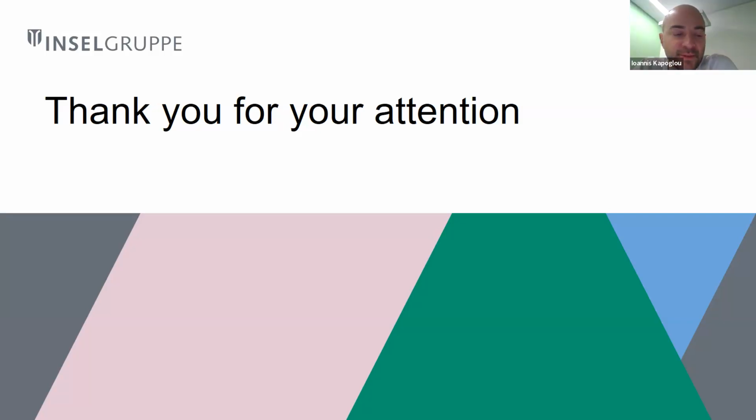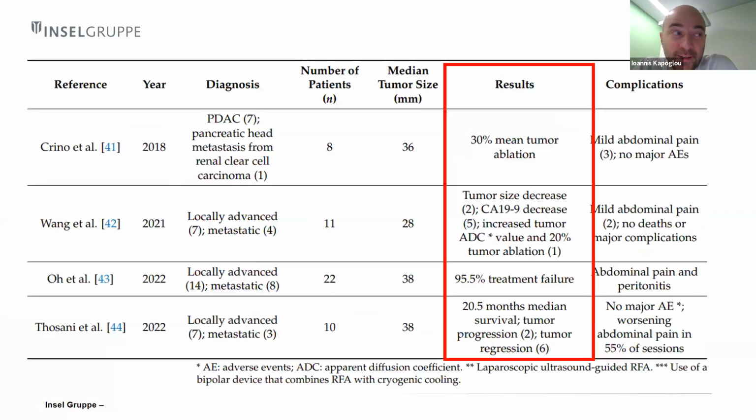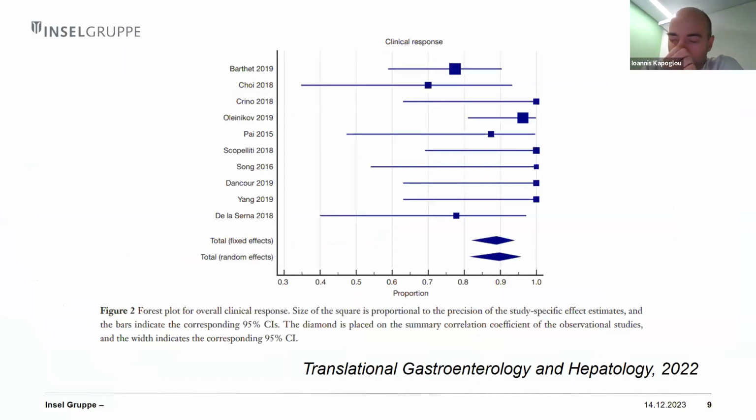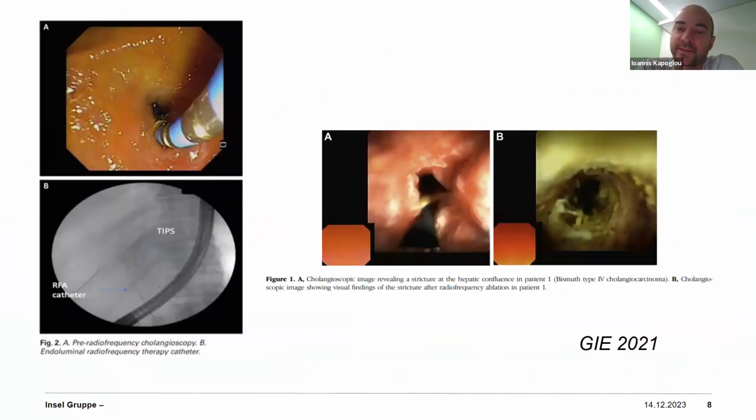Absolut, Vanessa, es gibt durchaus Daten, sowohl für die intraepithelialen Neoplasien vom Gallengang, aber auch für die Papillenadenome mit Beteiligung vom DHC. Wenn man das Papillenadenom abgetragen hat und noch kleine Reste im DHC drin sind, kann man noch RFA intraduktal machen, um diesen Resttumor zu abladieren. Und auch für andere Patienten, die nicht fit für Chirurgie sind, ist das durchaus eine valide Option.